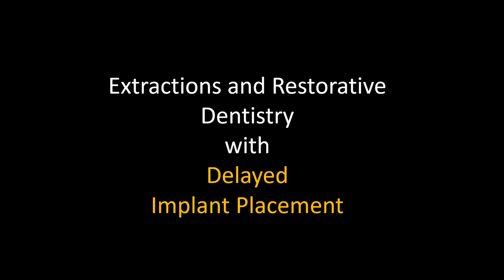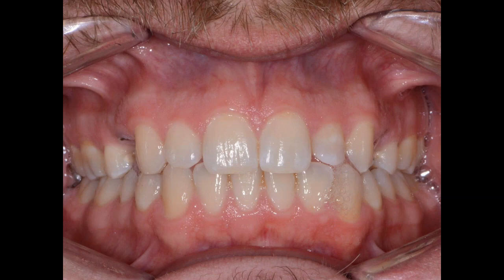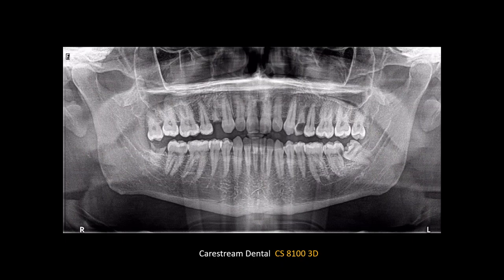Well, let's take a look at extractions and restorative dentistry with delayed implant placement. So in some cases, when patients come to my practice, they may have a variety of different scenarios. In this particular patient's case, we saw a couple teeth that were decayed down to the roots, but we also saw some areas of decay where the teeth did not have to be extracted, but in fact, these teeth just needed some restorative dentistry.